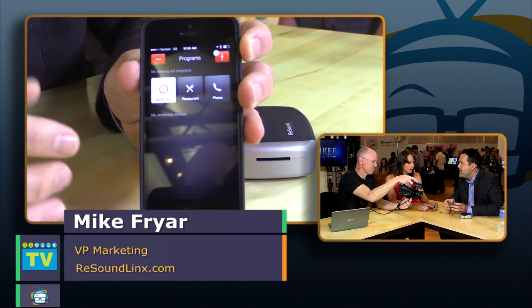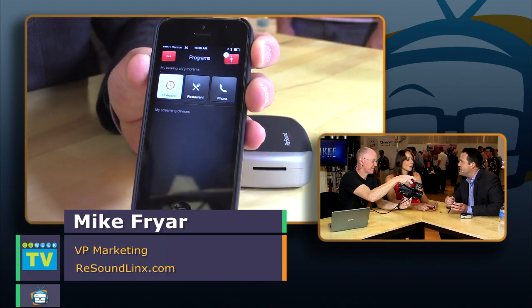That changes the programs. So the other thing is you can have your audiologist set up special programs so the hearing aids work even better in everyday situations, in restaurants, when you're on the phone. There's dozens of different settings the audiologist can put in there. And I've heard stories about how this technology works from a situational awareness standpoint. They do a lot of studies, and they go into places like restaurants, and they record all the ambient noise.